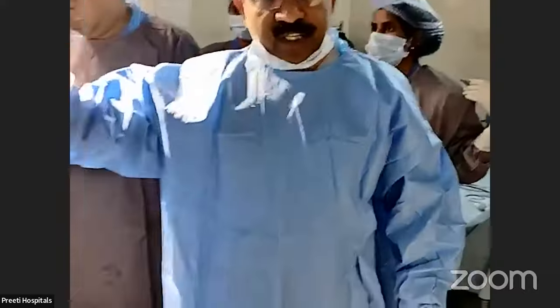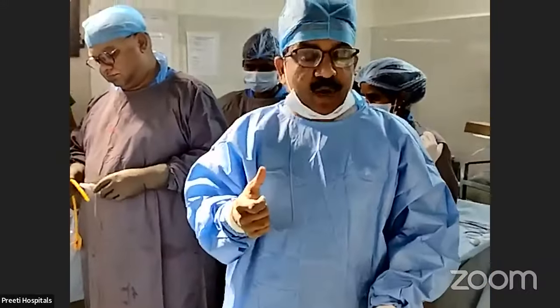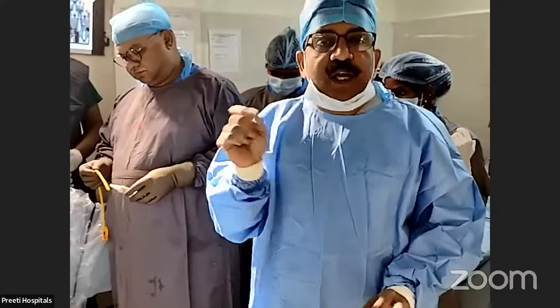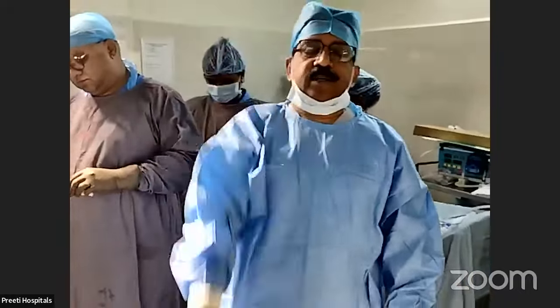Meanwhile, keep on seeing this. Here, this boy who is intelligent has applied pressure on the penis and decreased the size of the penis by pushing it, like in TURP, what you do. And I apply a little bit of control at the scope. Then it went up to the mouth of the infundibulum of the upper calyx. Thank you.